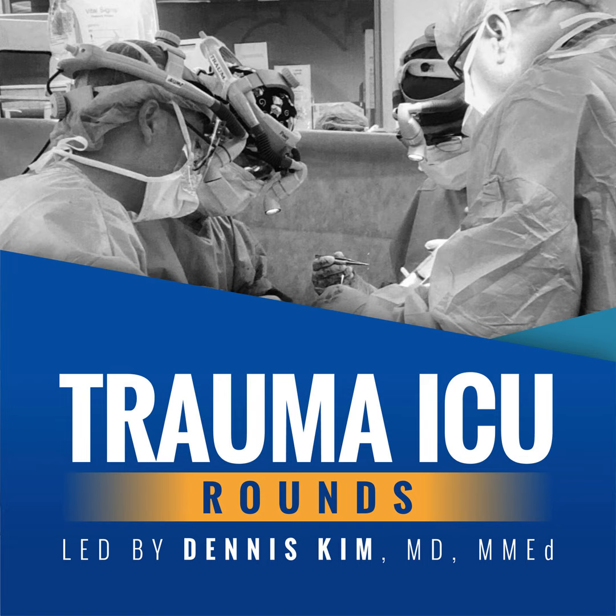So getting back to our mechanically ventilated patients, you can imagine that those patients who are not tachypneic and drawing in large tidal volumes would have a low RSBI score, and you would think that this might be predictive of extubation success, but in fact it's not. If you actually look at the data and the evidence, it would suggest that a negative RSBI, or a score greater than 105 breaths per minute per liter, is actually better at identifying patients who will fail weaning than a positive RSBI is at identifying patients who can be successfully weaned.